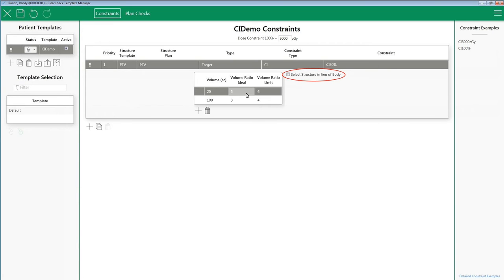In this scenario, you may desire to look at the conformity index of each target individually and not have the volume of an isodose line be added together from both targets. In essence, you want to isolate each target's own conformity index. This setting allows that to be done.